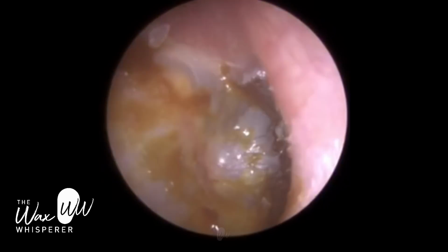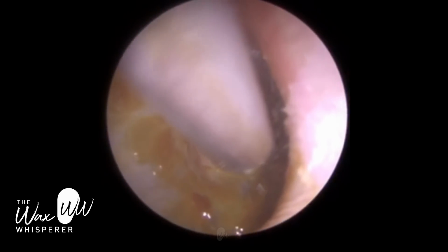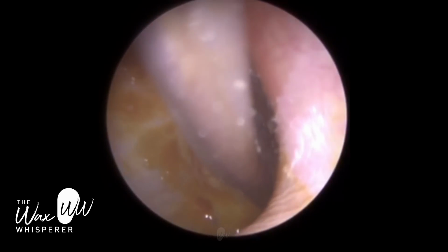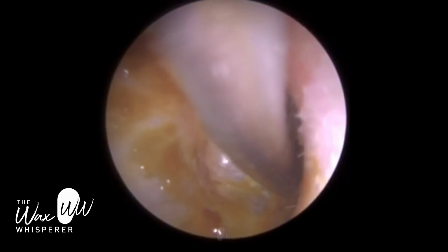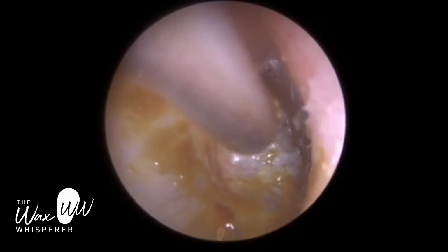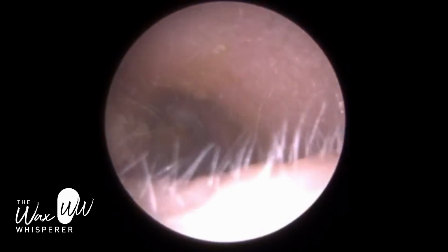So I'm nearly done. I think it's just a bit left in the anterior. I'm just seeing if I can get a bit more out. And there's a point where we have to stop. We think, well, I don't want to risk perforating that eardrum. So I'm happy with what I'm doing, and that's all that matters really. And this will all dry up now and naturally migrate out of the ear. Let's just see how much more I can get from the anterior recess. So I think I've just called it a day there, but much, much better than before.